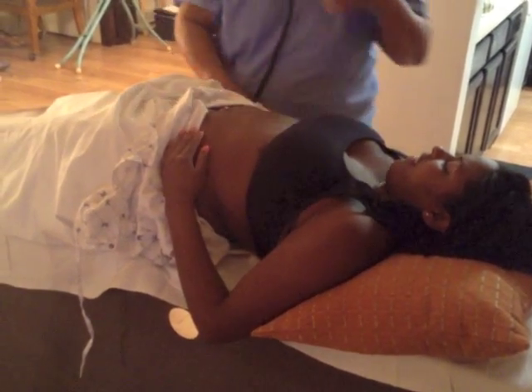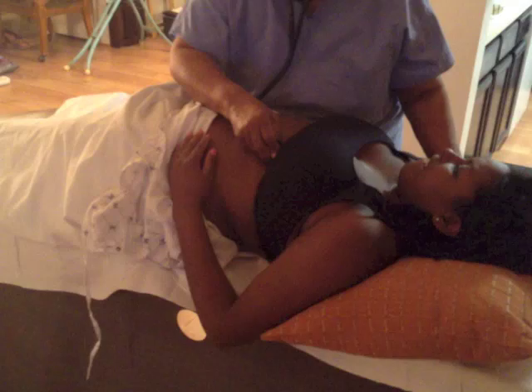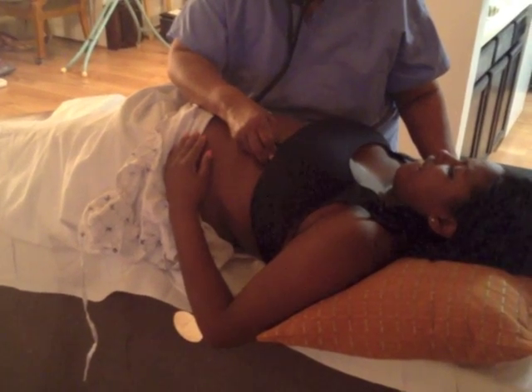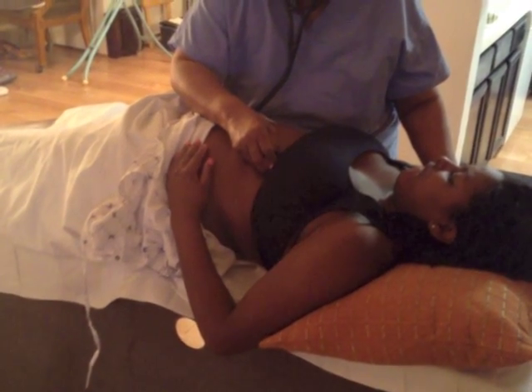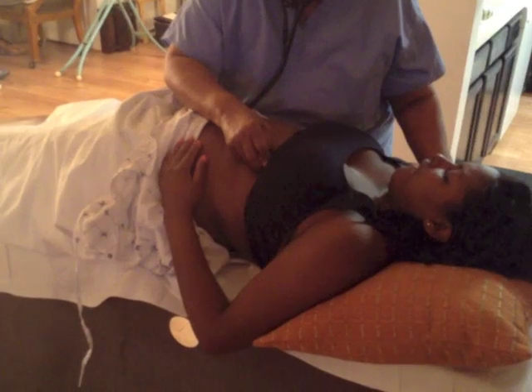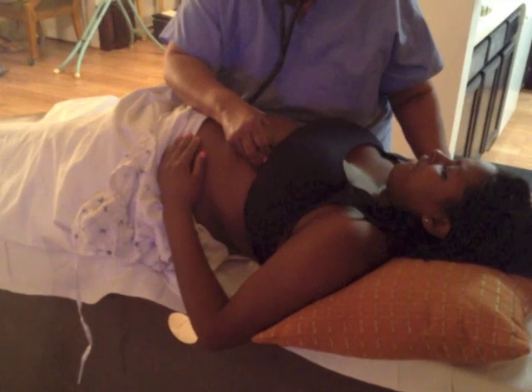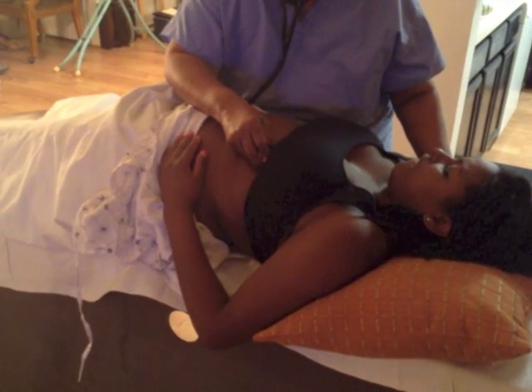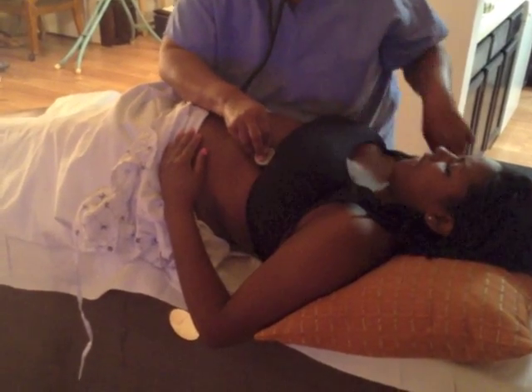So now I'm going to listen to your apical pulse. Apex is the mitral valve, tricuspid valve closing, the S1, S2, pulmonic valve. Okay, I'm listening to the apical pulse through my scope.